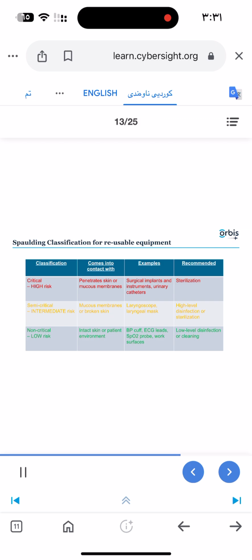Some items of anaesthetic equipment are recommended as single-use, for example endotracheal tubes, Guedel airways and suction catheters, as they become readily contaminated with blood and transmissible organisms. Please see the Resources tab for further information on this topic.